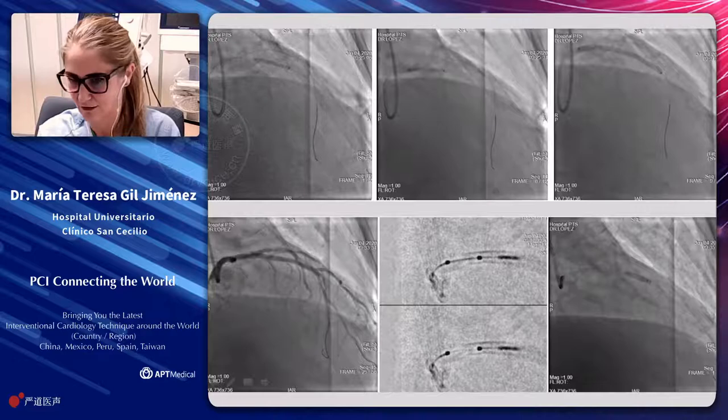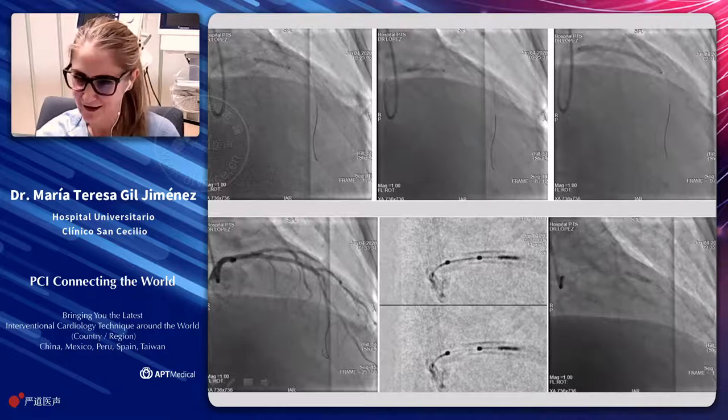Our colleagues said that these kinds of balloons slide very easily. After the post-dilatation, the FFR was negative in this case.